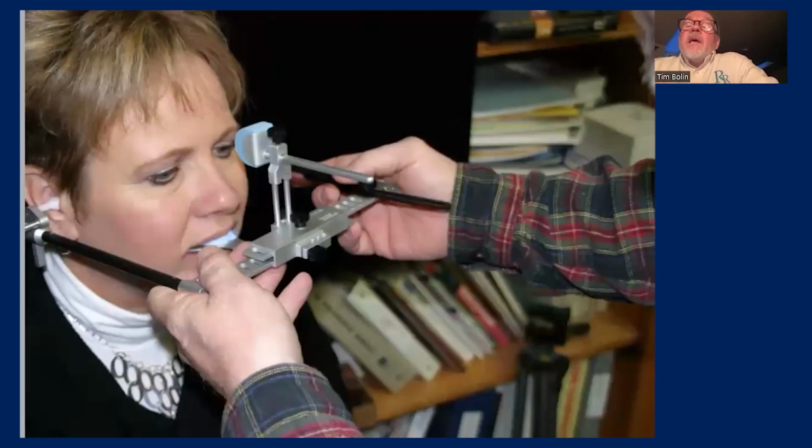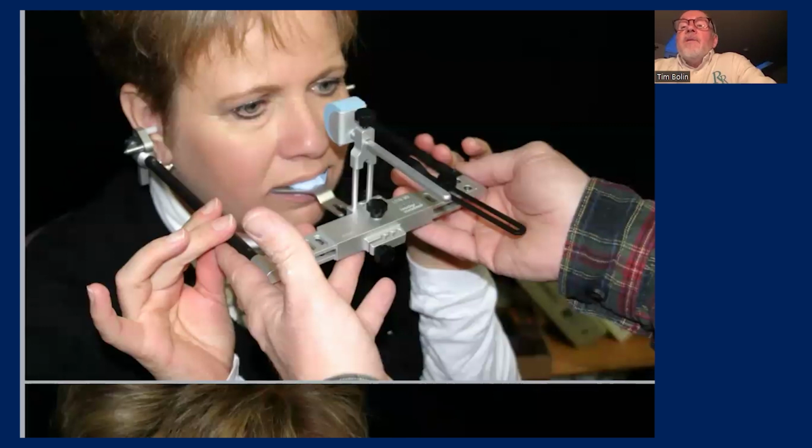So what I do is I put the transfer bow in the ears. Now I don't force them in there. I'll have the patient put their hands on the side and just push them in till they're comfortable. That's what I've got Karen doing here. She's just guiding them in there so she's nice and comfortable with everything that's going on.